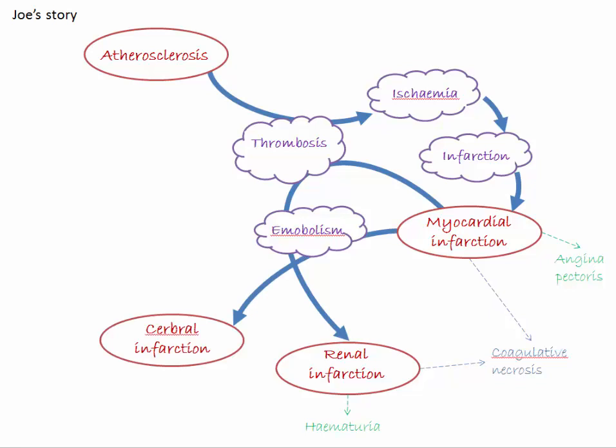The next slide we saw was again related to that same phenomenon. Again, thrombus on the left ventricular wall, a mural thrombus, breaking off and embolizing to form a thromboembolus that lodged this time in the cerebral vascular arterial system and caused a localized area of infarction within the brain. And that localized area of infarction produced obviously significant clinical effects in Joe, which we refer to as a stroke or a CVA, cerebrovascular accident.